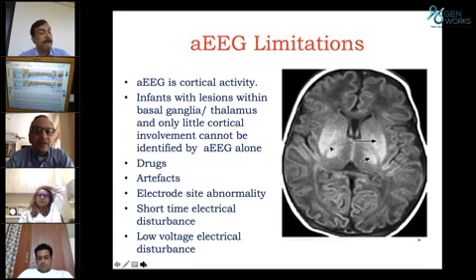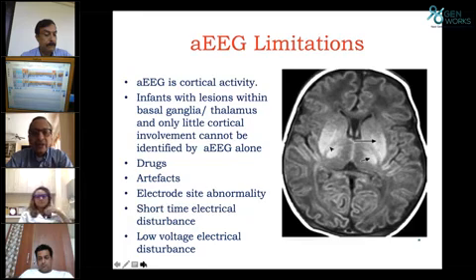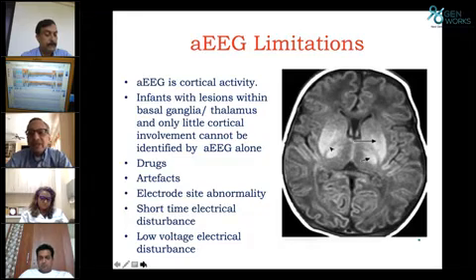Artifacts have also been well described. I think again it's true for any artifact that will impact EEG. So your high impedance, if you have injury to the scalp or swelling on the scalp, you're likely to get artifacts. Interference from other equipment around. EKG or ECG artifacts sometimes will come through. So it's important to try and capture ECG traces, as Dr. Monica mentioned earlier. But again, these are inherent with any kind of EEG recording.